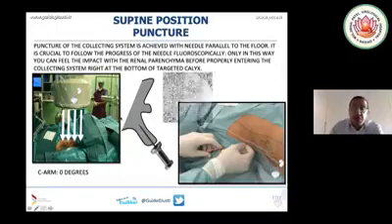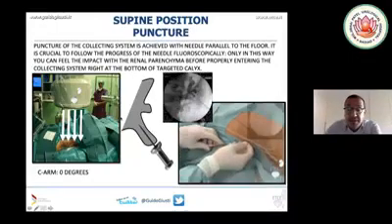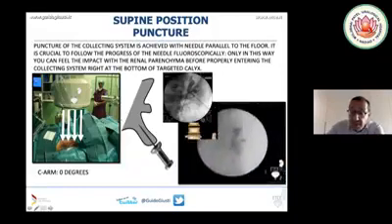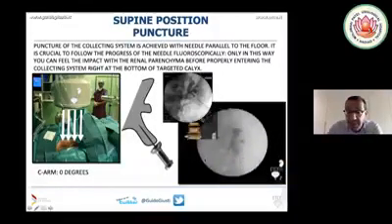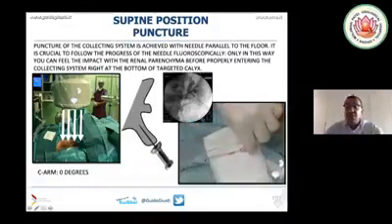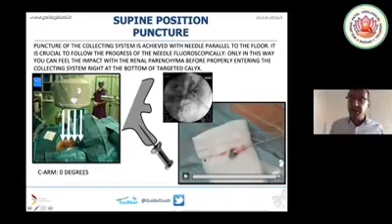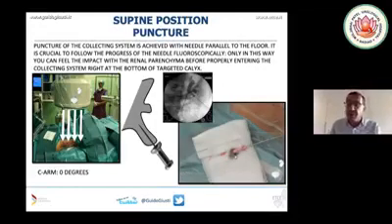So I start to target my calyx in 2 dimensions. And when you see the kidney moving under the action of my needle, usually I am in the correct plane. And believe me, most of the time, I enter the kidney at a very fast effort. Another advantage is that in supine, if you are in, you will have automatic dropping out of the urine. You don't have to do suction.